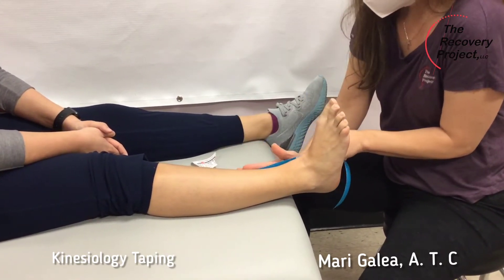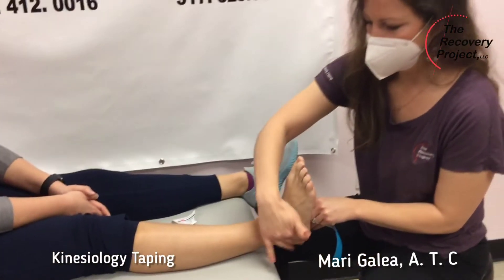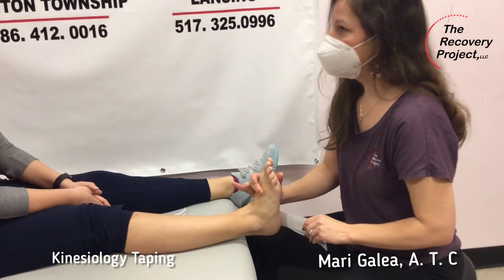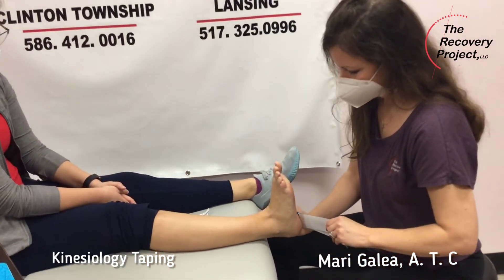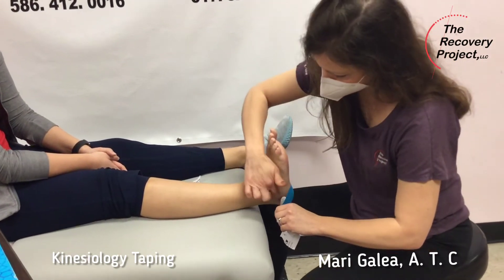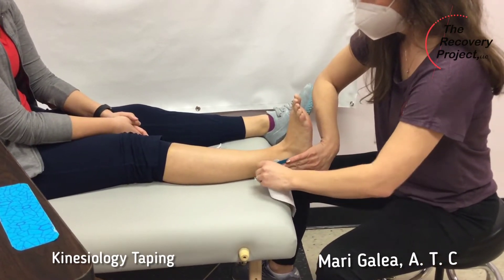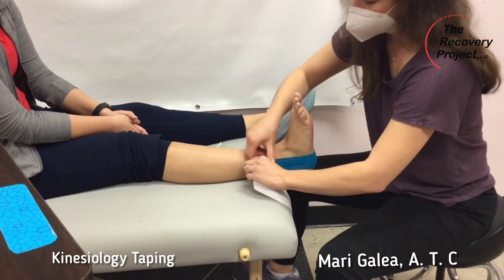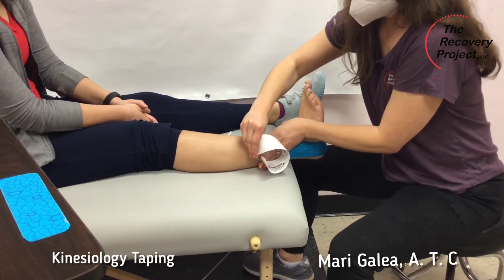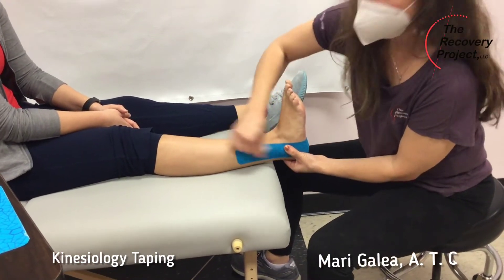I'm going to do a gentle tension on the ankle taping because I want to help offer some lateral support for the ankle. I'm going to have you pull your toes up a little bit. We're going to place the tape across the bottom of her heel, and then we're going to go up laterally on the side. I'm going to offer a little bit more tension on that tape, and then I'm going to rub to activate the tape.